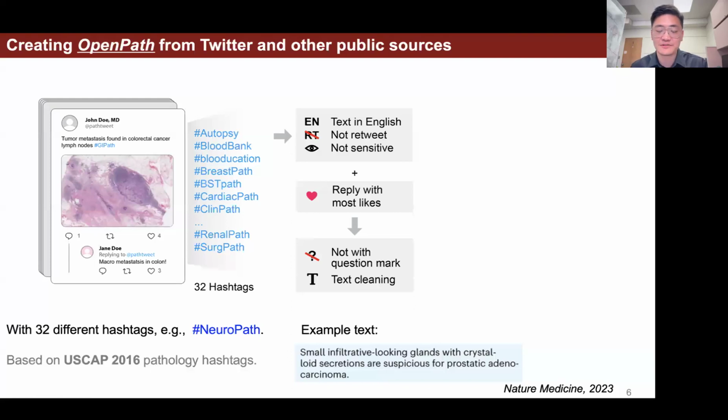In some other captions, it may also contain location information, such as "neoplastic cells are forming a cluster in the upper right." That information is really useful for a model to learn spatial textual information and try to connect those two pieces of information together, right? And so later on, we get a bunch of that kind of image-text pairs.